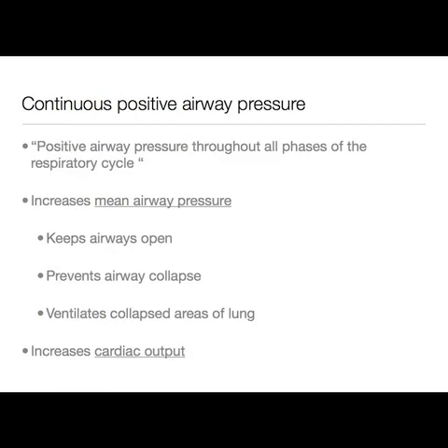So CPAP, which stands for Continuous Positive Airway Pressure, was first introduced in the 1980s as therapy for obstructive sleep apnea to prevent pharyngeal collapse. In CPAP, a positive airway pressure throughout all phases of ventilation, so inspiration and expiration, is applied.